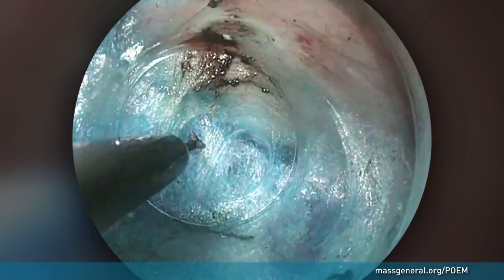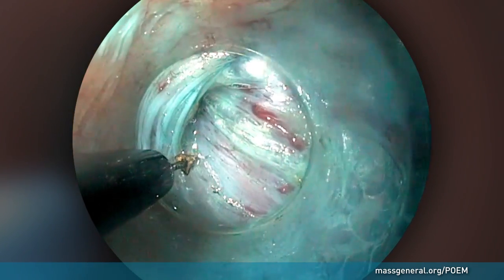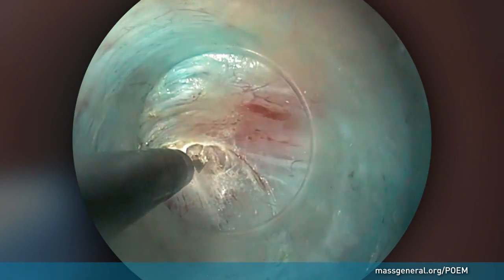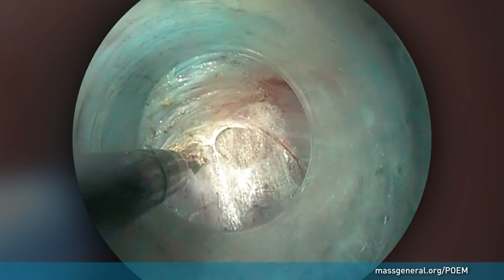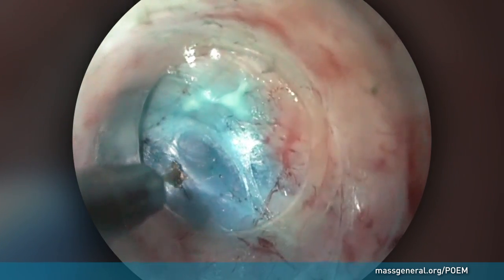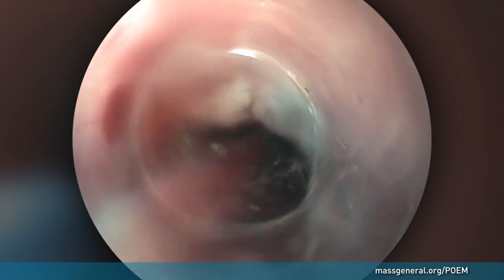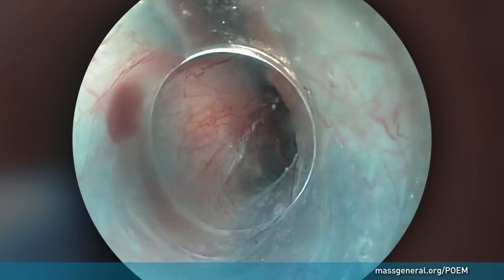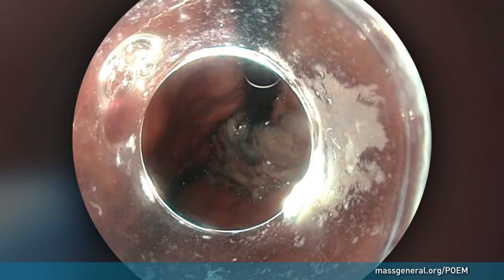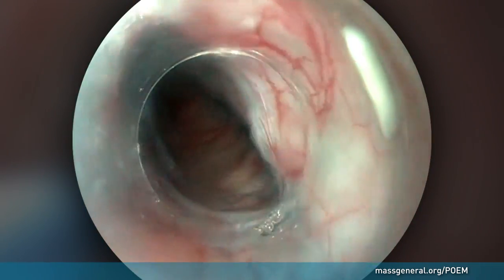At that location, the muscle fibers of the sphincter area are clearly visible. The separation of the mucosal lining and muscle wall continues past the sphincter area. Once the tunnel is completed, the endoscope is withdrawn and reinserted through the natural opening of the esophagus to check the length and integrity of the tunnel. The surgeon uses a camera view from the stomach to confirm that the tunnel extends below the esophageal sphincter.